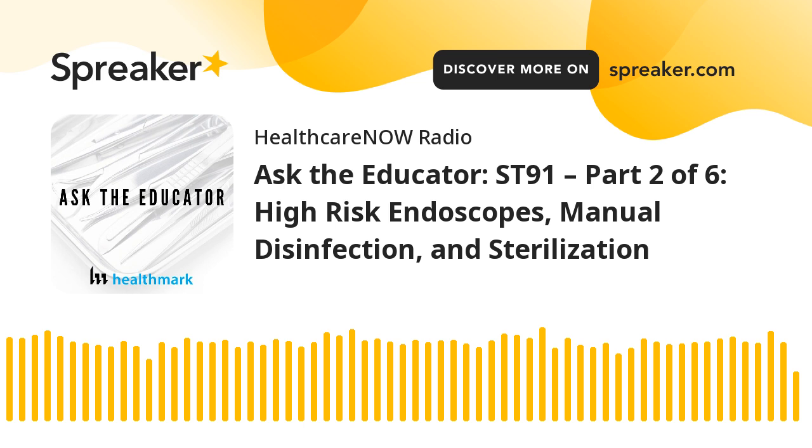We heard a couple years ago from the FDA, and then through IFU changes, that your ureteroscopes should be sterilized, removing mention of high-level disinfection, so make sure those are being sterilized in your facility. Then move on to your cystoscopes. The one that I am passionate about is bronchoscopes. When I do audits of facilities, it's one of the first things I look at and ask: what are you doing with your bronchoscopes?